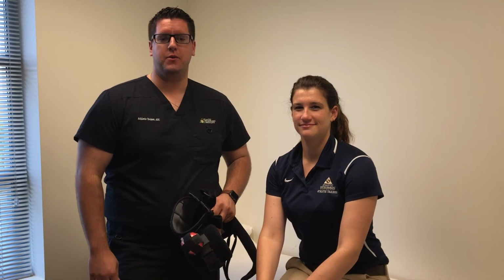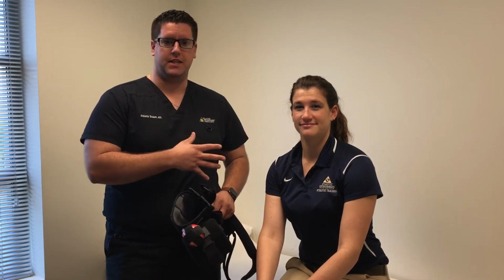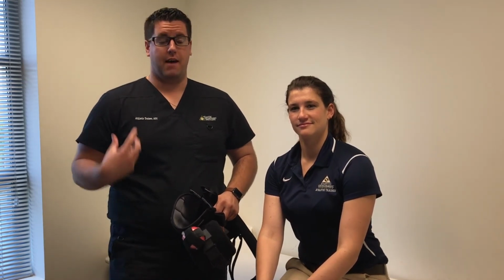Okay, so now that we've reviewed the anatomy of the sling and you understand all the straps and how they work specifically, now I'm going to apply it on Christine here so that you at home can feel comfortable as well when you are having to reapply your own sling after showering and getting dressed and having to deal with a rotator cuff repair or a labral repair.